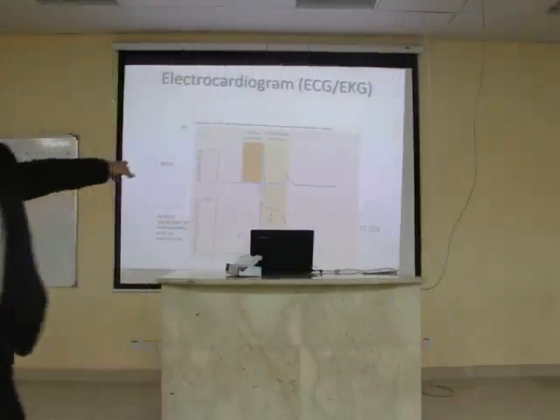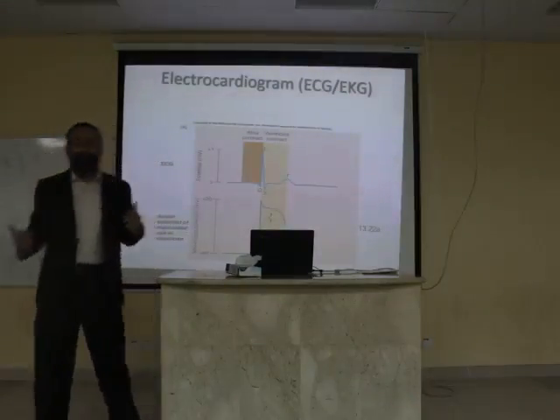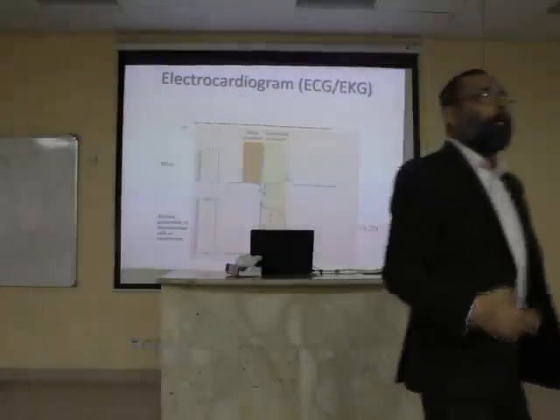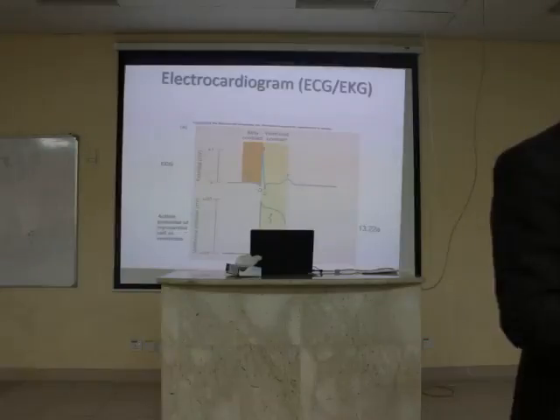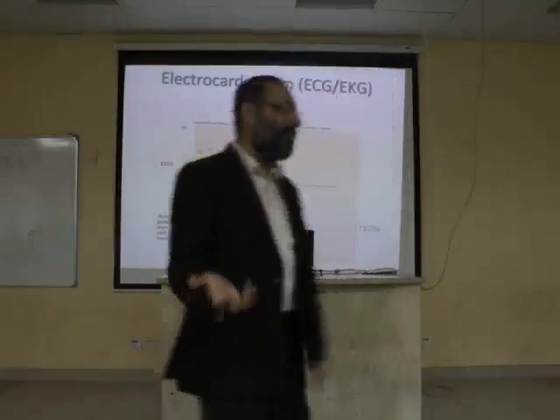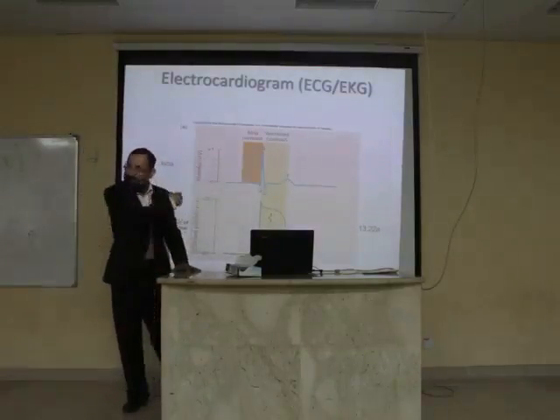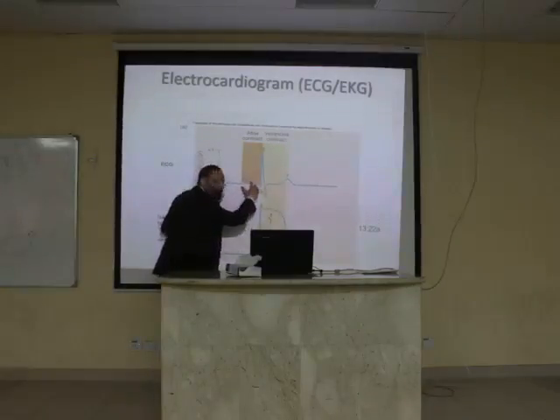Look at this PQRST and see what you see as missing, which is really not satisfying us. Repolarization. Very nice, Turki. He said that you talked about atrial depolarization and jumped to ventricular depolarization. Did you forget about it, or did you deliberately leave that? You don't see any change for the atrial repolarization. Do you see it here? No. We did not discuss it. Actually, this is atrial depolarization.